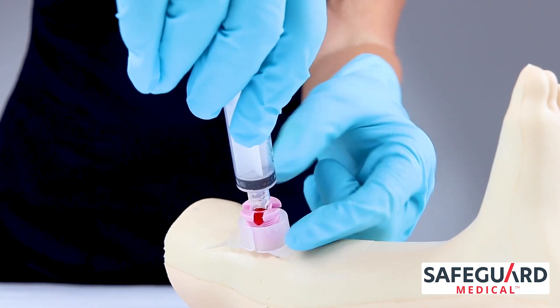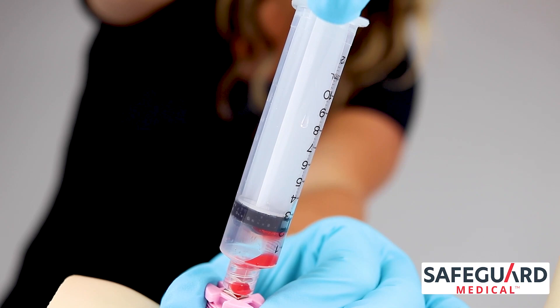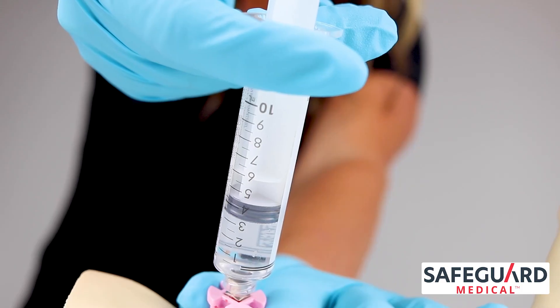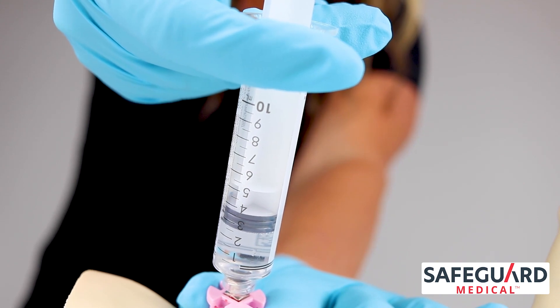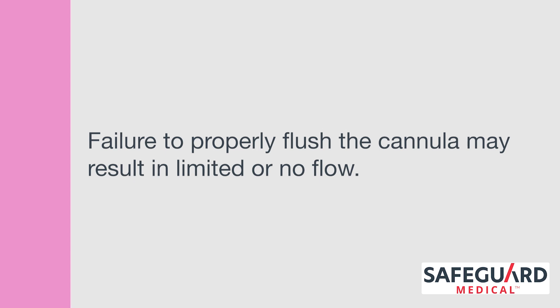Connect a syringe and confirm a secure fitting. If desired, aspirate for bone marrow. Always confirm successful placement by flushing with 2 to 5 mLs of fluid, or per your institutional protocol. Failure to properly flush the cannula may result in limited or no flow.